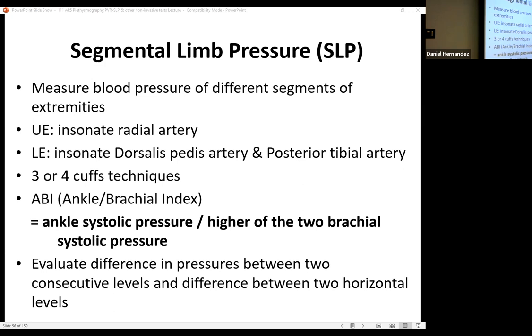I get that, but why is it only one ankle pressure? Why is this not the highest? Well, we take the highest of either the posterior tibial or the dorsalis pedis. We take those 2, remember I said go with the highest of the 2 to do the rest of your study. So it's your ankle systolic pressure, the higher of either the PT or DP.